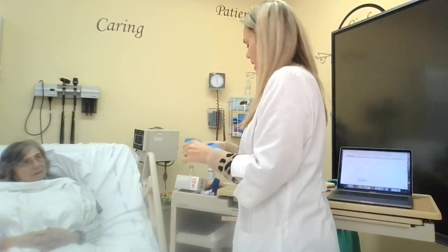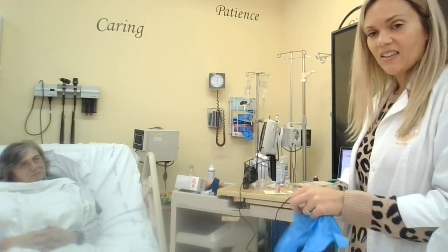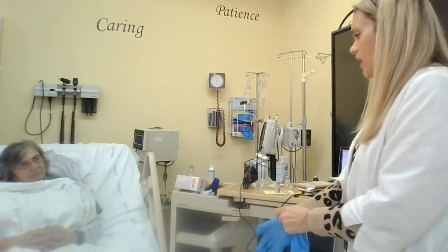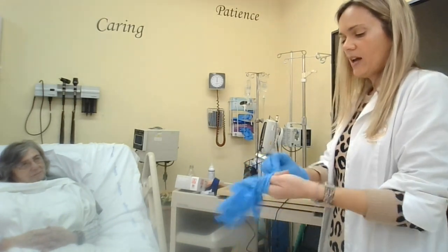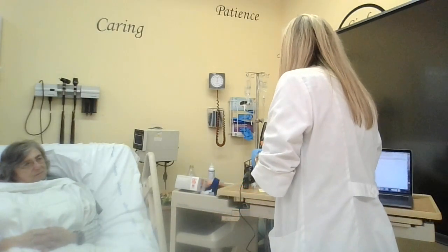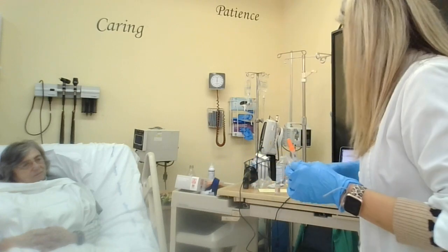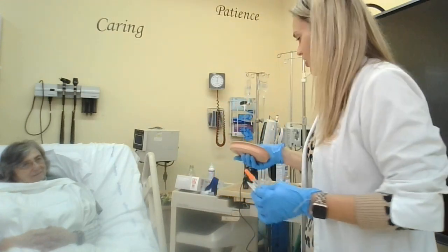Okay, well, we'll do the abdomen. You probably have the chart where it was last anyway. Yes, I can see they gave it to you last in your arm. So I'll check your abdomen, and if it looks okay, we'll do there. So I'm going to go ahead and put on my gloves. And I've got my medication. And what we'll do is, because I'm not going to do this to poor Dr. or Miss Jones, I'm going to give the injection in here, okay?